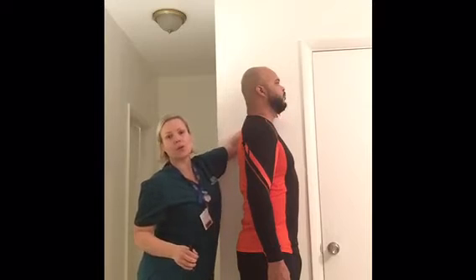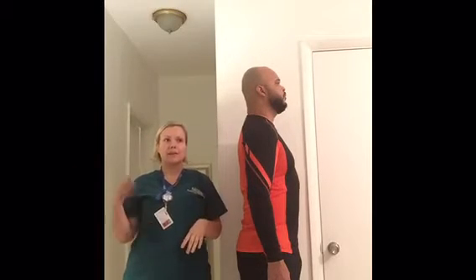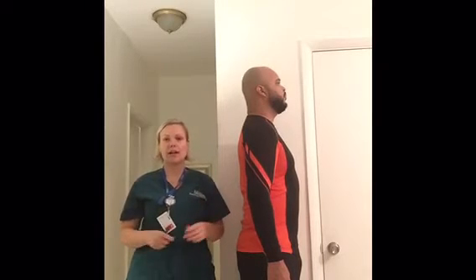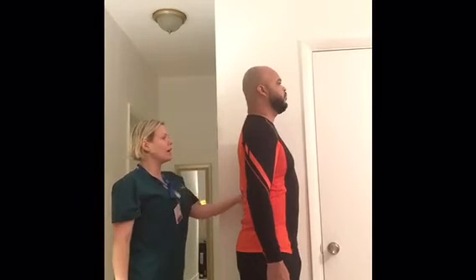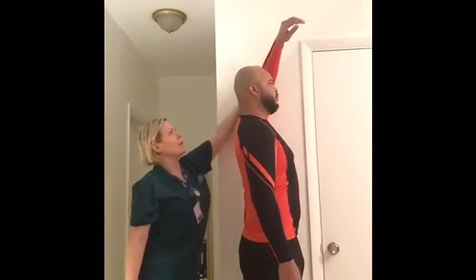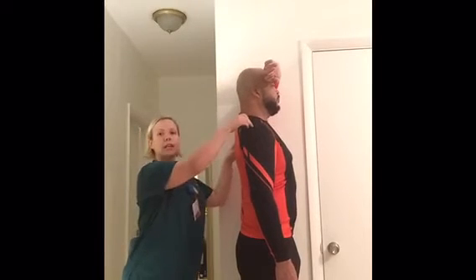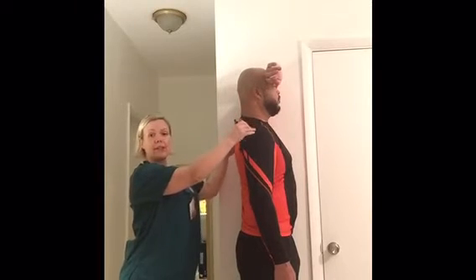Then we're going to do a swimmer position, to see everything that you didn't catch on the prior images. So we're going to ask our patient to put the left shoulder up, right above the forehead, and then push the right shoulder down to make sure we have enough space.